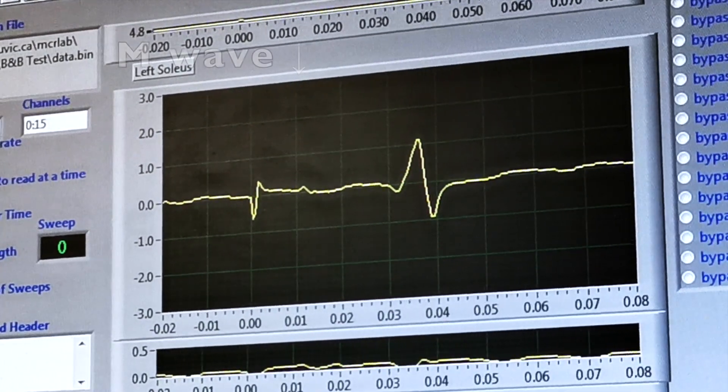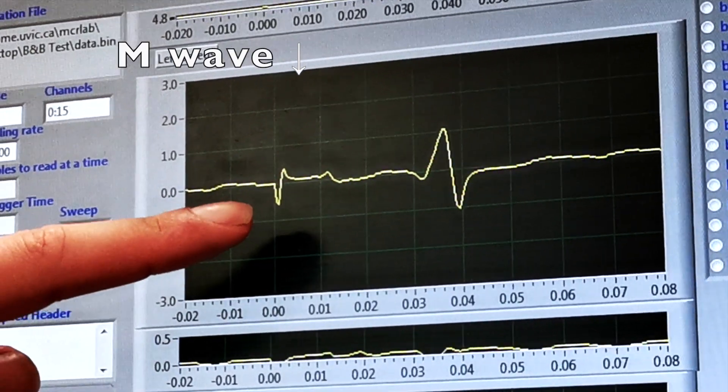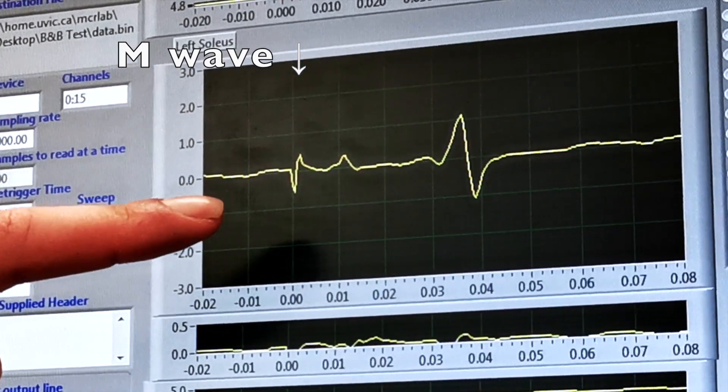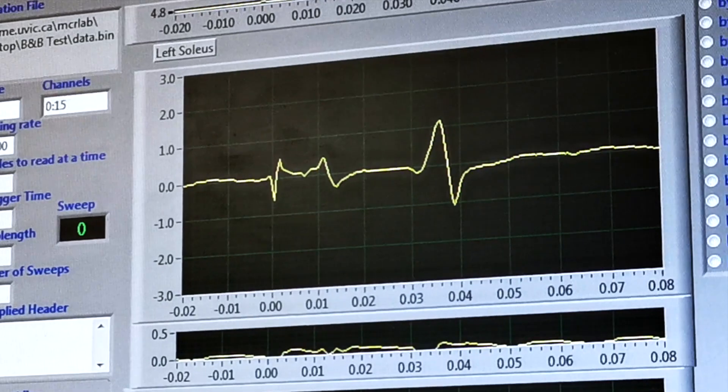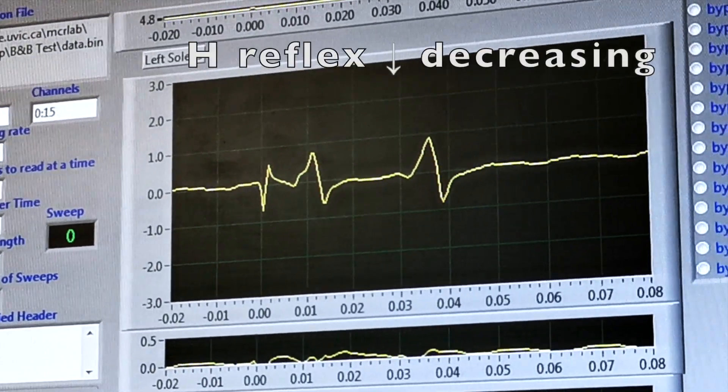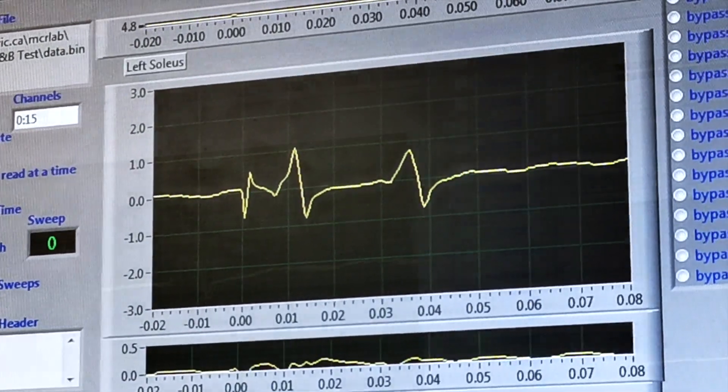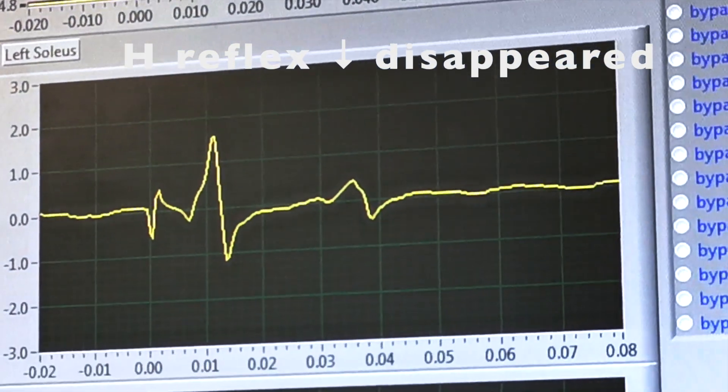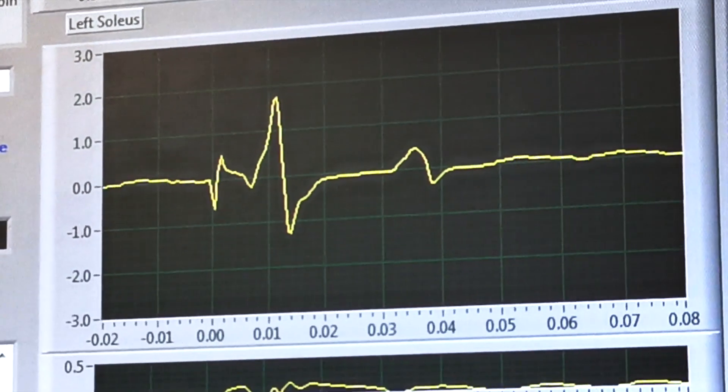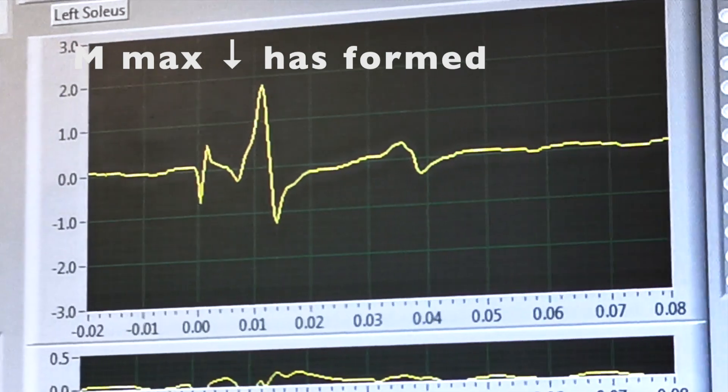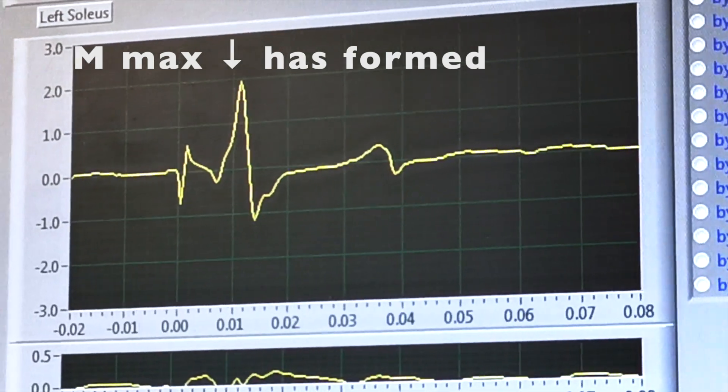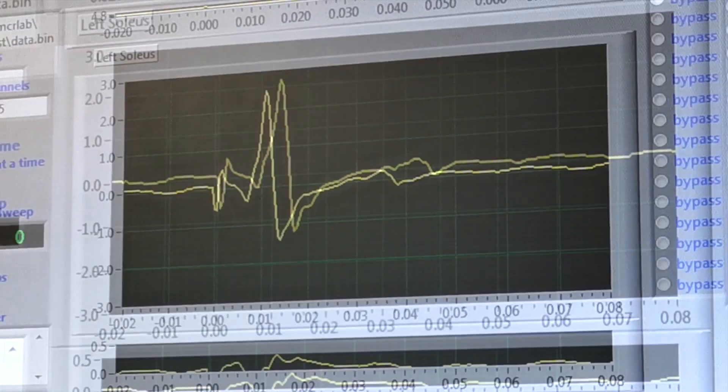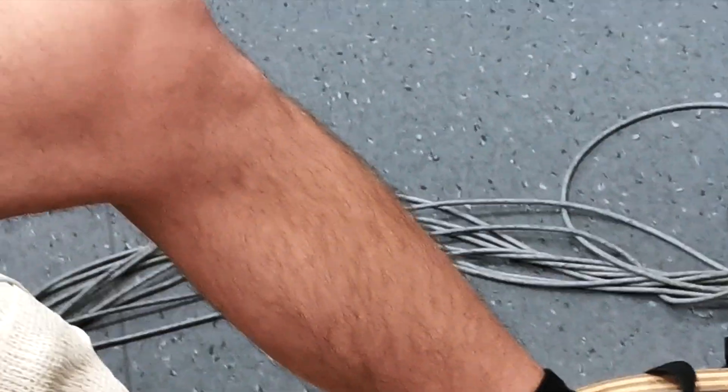So the M wave is just turning right there. Perfect. Keep going until the H decreases. There you go. The H is decreasing. Once we see the M max, all of the nerve fibers have been recruited and we can see the reflex response in the participant's leg.